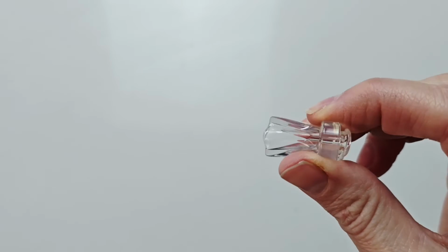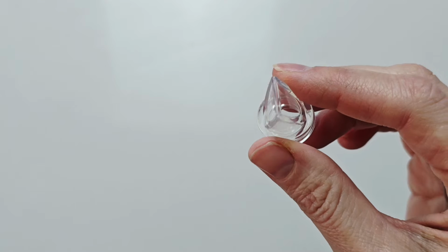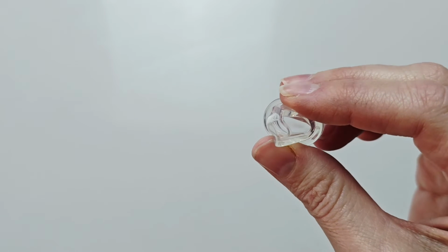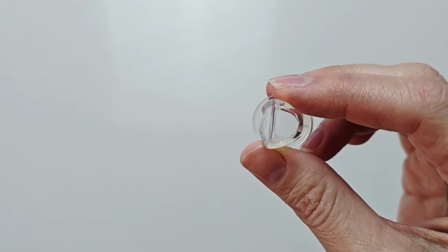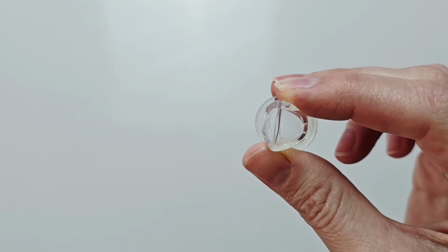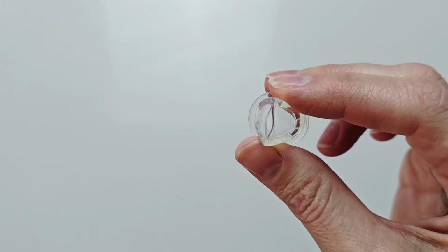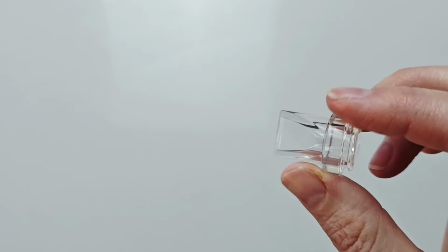You want your duckbill valve to be nice and firm. When it's in your pump and pumping, you will notice that these go in and out. And when these get worn over time, you'll find that they start to stay open a little bit. And this will be reducing your suction and therefore your overall output. So we want to make sure these have a nice seal on them and that they're not all worn out. So every 1 to 3 months, depending on how often you are using your pump.